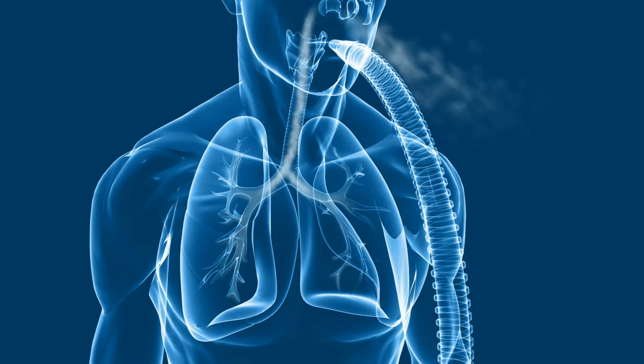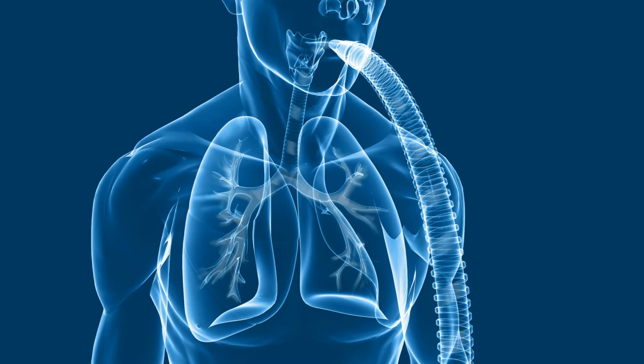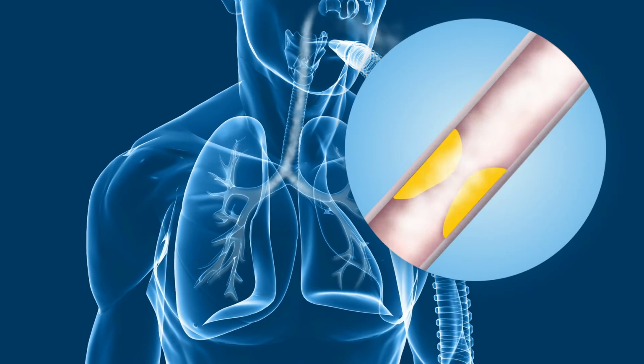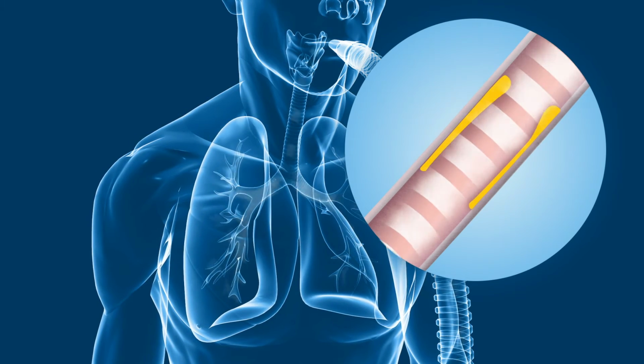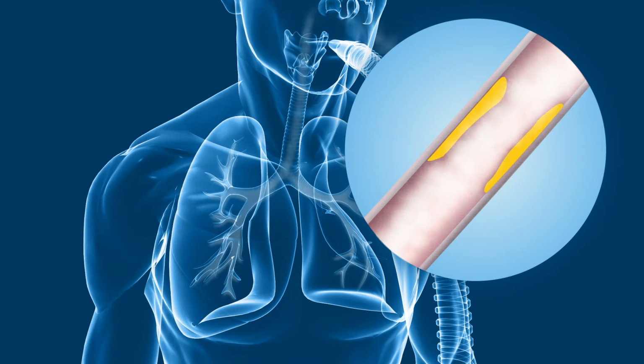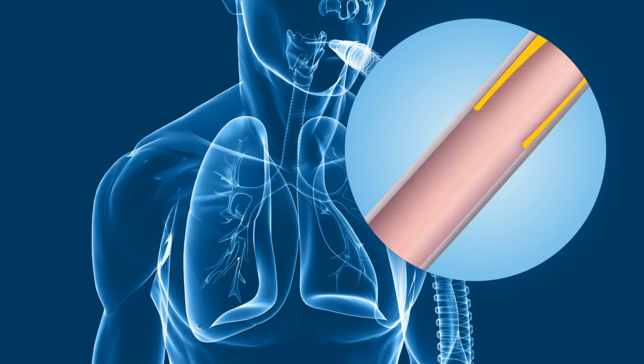Between each point depression, the patient is connected to atmospheric pressure, which prevents any compression of the bronchus. During the expiratory phases, the mucus deconstructs rapidly. It's transported and drained. During the inspiratory phases, it resumes its original form and properties and remains stagnant.